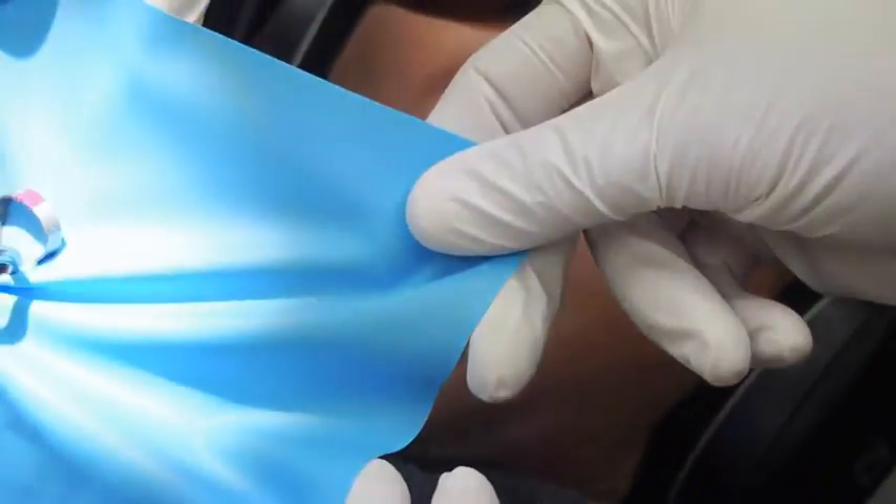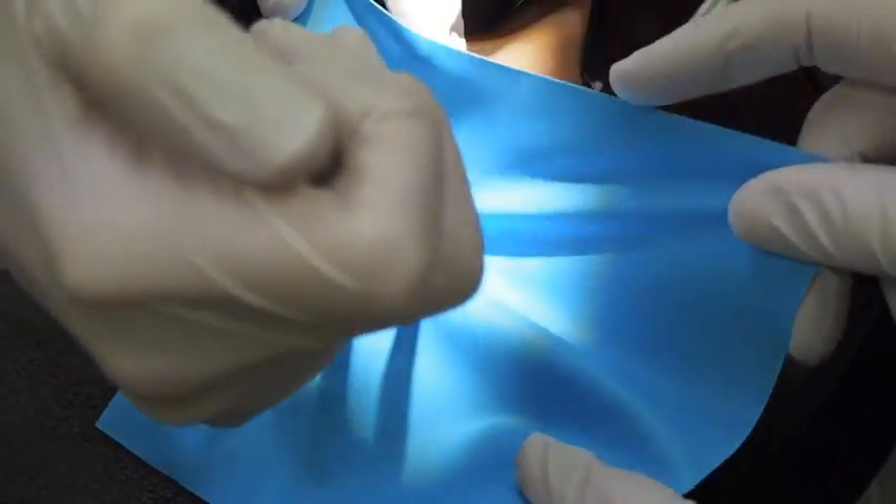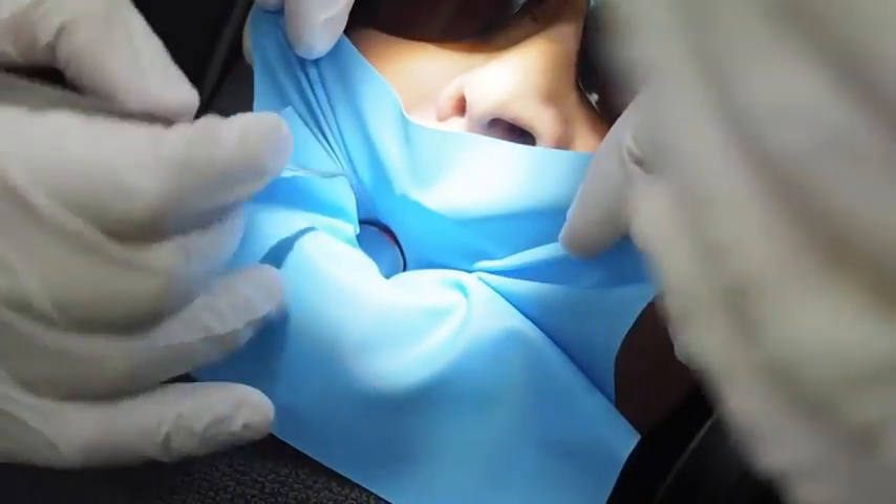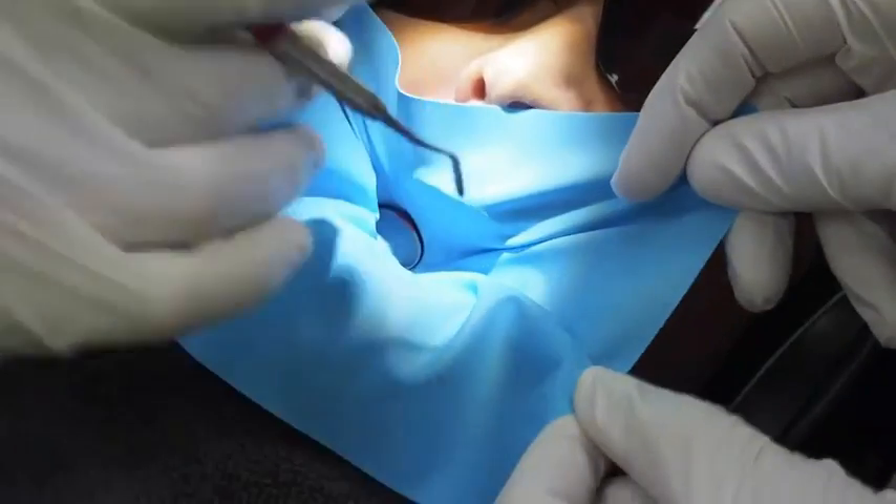It's important to have both the buccal and the lingual tissues completely anaesthetised. If you're placing the clamp and they're not anaesthetised, you won't place it properly and you'll have the clamp fly across the room.